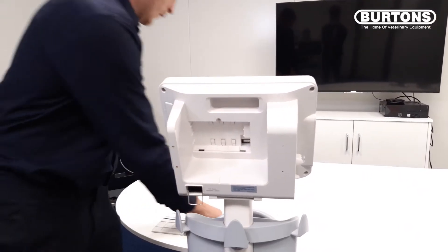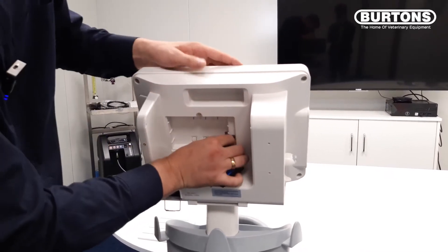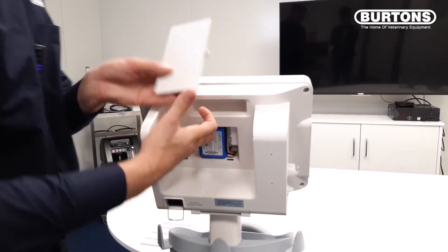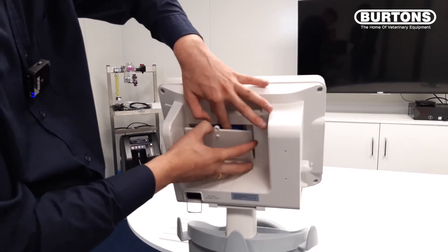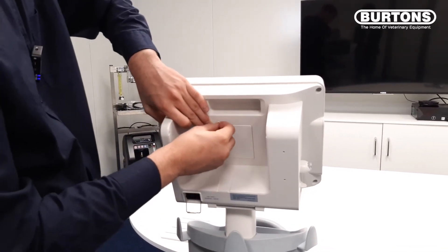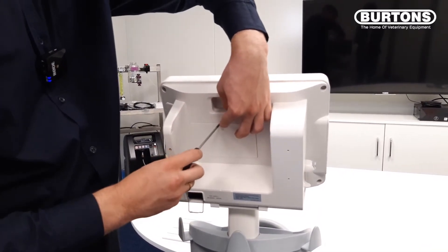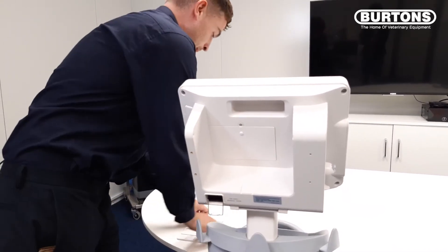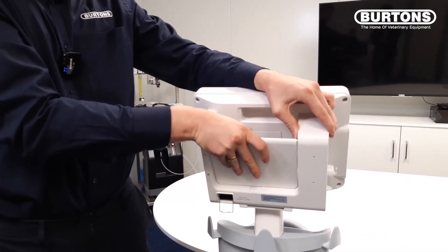We'll then take our battery and place it onto the connector. Then take our flap again, place our screw back in, and screw it back on. We'll then take our flap and put that on.